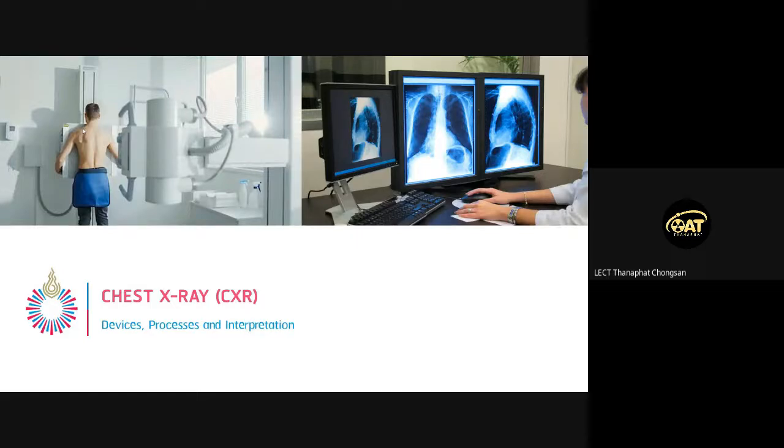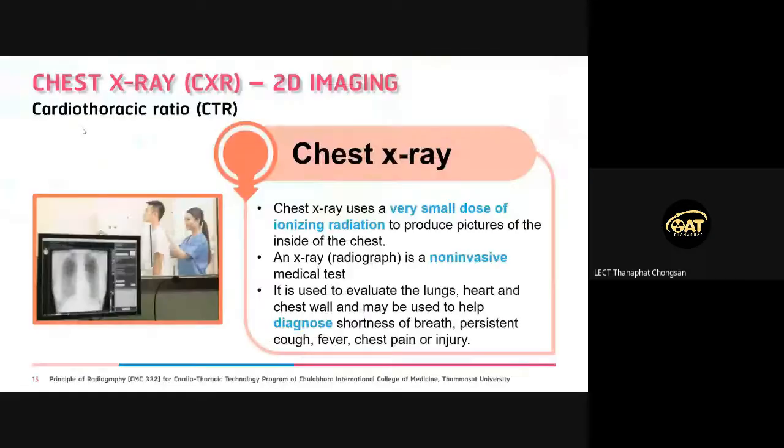Okay. Let's talk about the basic imaging of radiology. That is chest X-ray or CXR. We will talk about the device, process, and interpretation. For chest X-ray, we will talk about the Cardiothoracic Ratio or CTR, which allows you to estimate the size of the human heart.